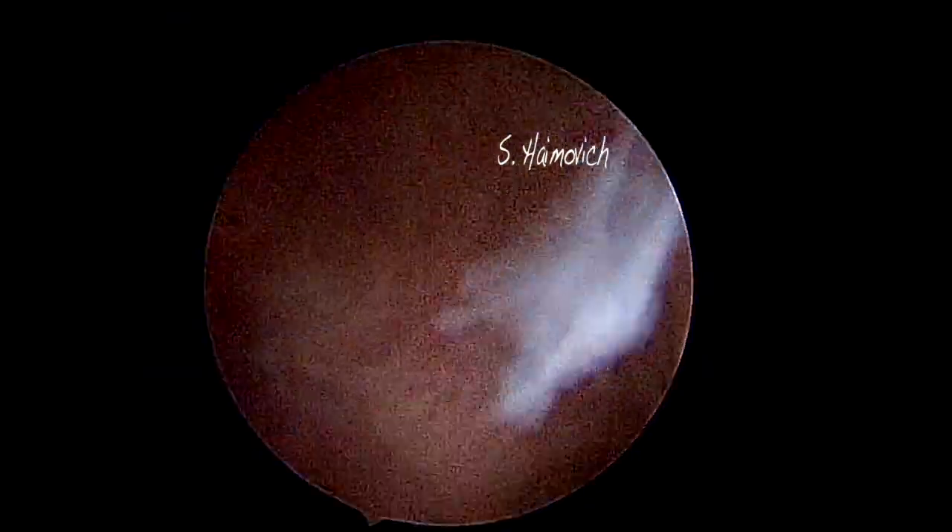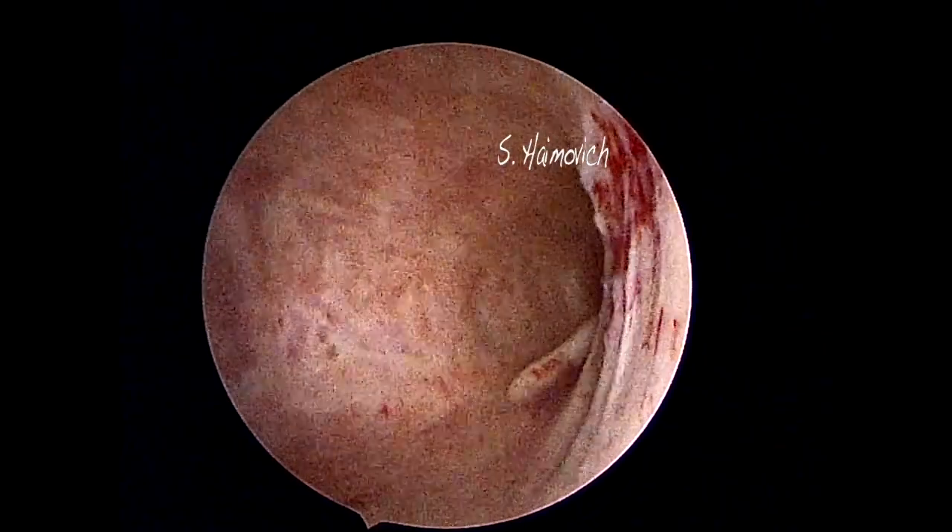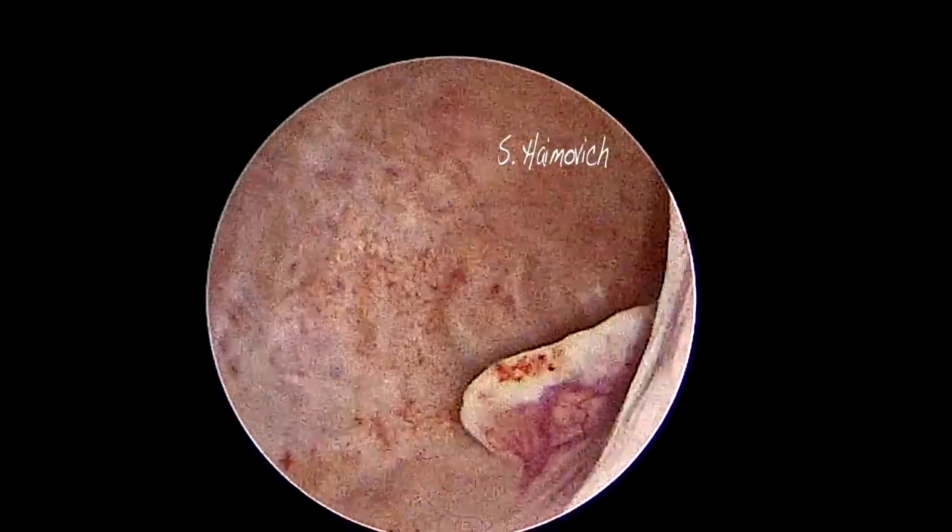We present a case of an office hysteroscopy procedure, without anesthesia, to a postmenopausal woman with a left precornial polyp.